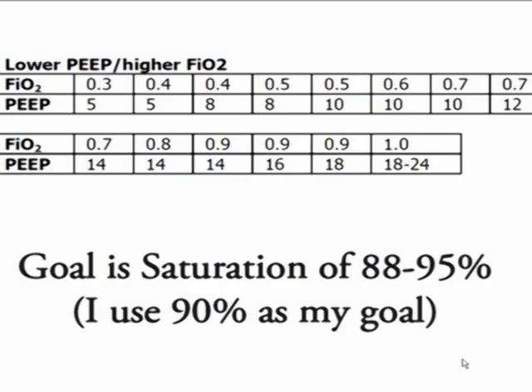Then, once they're at 30 or 40%, you're going to titrate their FiO2 and PEEP in tandem using a PEEP scale. This was from ARDSNet. They found when people do it this way, people live more often than the random guess as to what FiO2 and PEEP they need. So here's the way it works. Let's say you have them on 40%. You put them on 5 of PEEP to start off with. I keep all my patients who are not dramatically hemodynamically unstable on at least 5 of PEEP, just as a starting point. So I'm not running anyone at a PEEP of 0 or ZEEP.